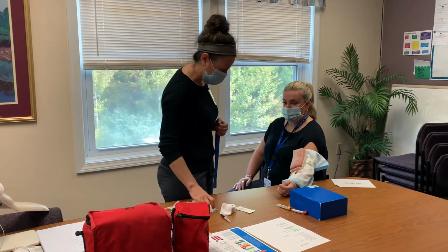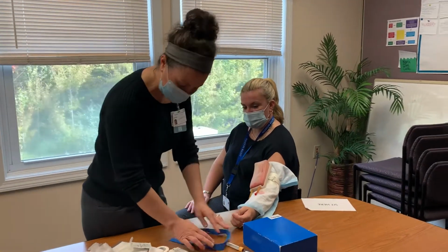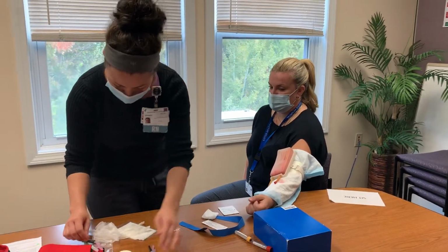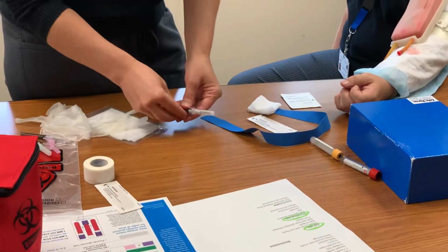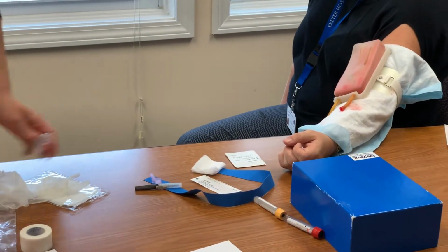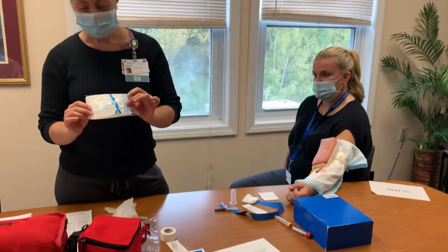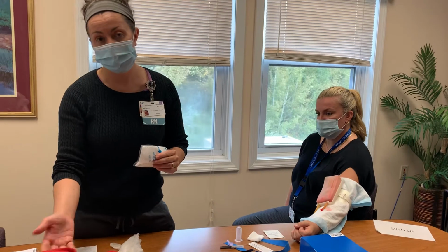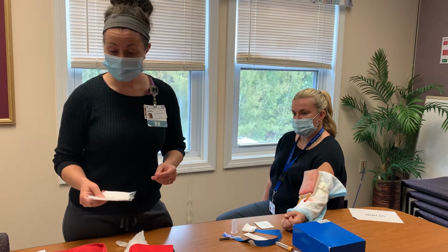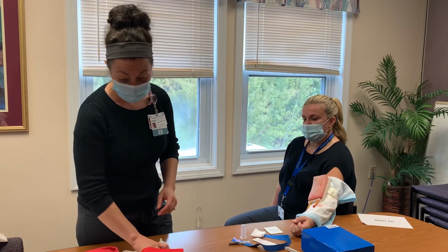All right, let's see what you got. So I'm gonna start by just checking her veins, although I know right here is where we're gonna go. I'm gonna gather my supplies, and I'm going to be doing a 22 straight needle today. One thing I also encourage is you can bring an apron to put under your bag. You never know what's in patients' houses, so for infection control purposes, aprons are also very good for your lab bag in addition to your clinical bag.